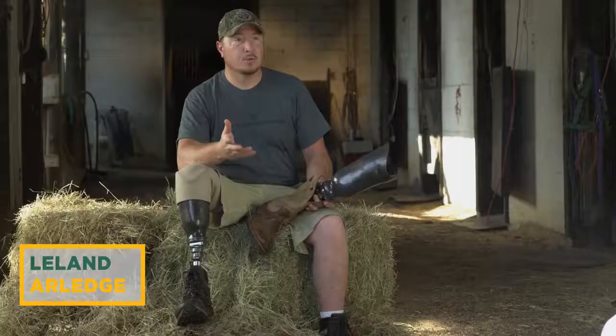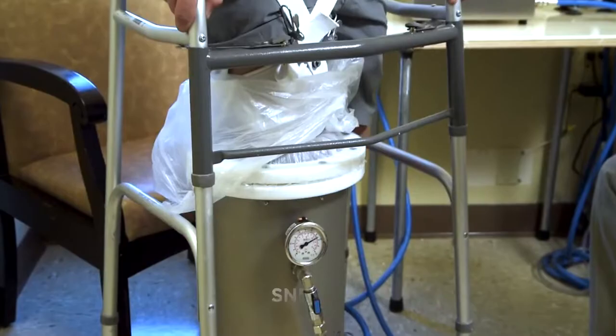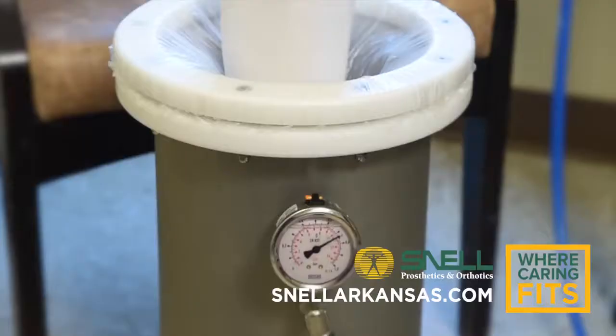The Snell AquaFit pressure casting system creates a close to perfect fit. With 360 degree pressure, they can actually create a more accurate mold to your leg.